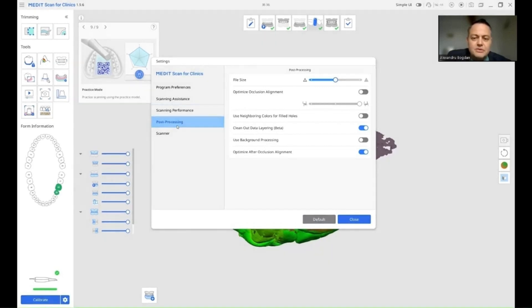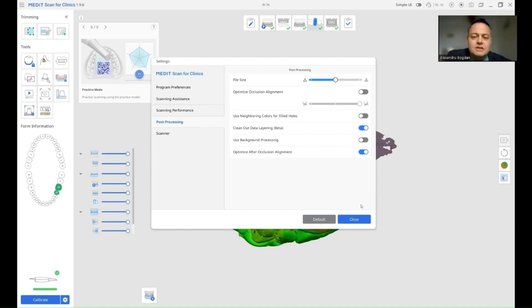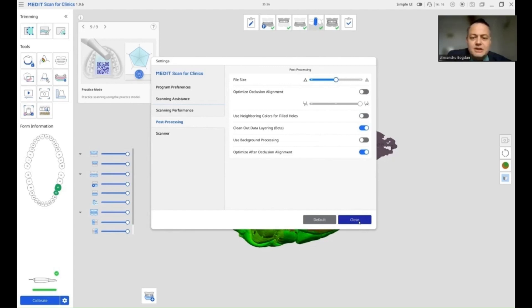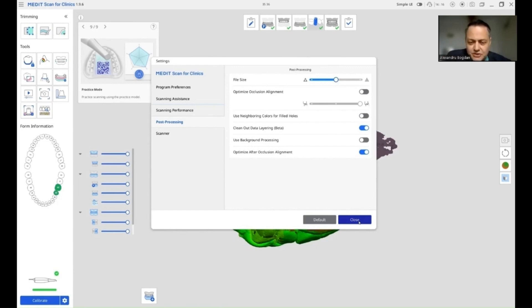Also, if you like filling holes, my advice to you would be to never check use neighboring colors to fill holes. Because if you do so and the software approximates filling a hole, this is what it does, it's just an approximation of the surface that is missing.